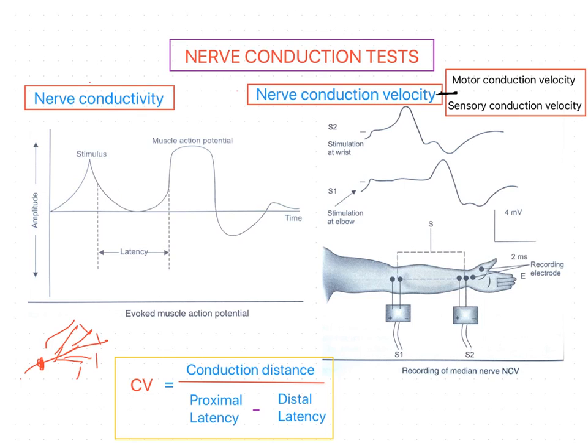Comparison with the strength of stimulus required to produce a similar reaction on the unaffected side of the body gives some indication of the severity of the lesion.